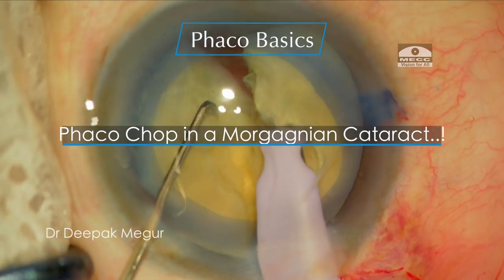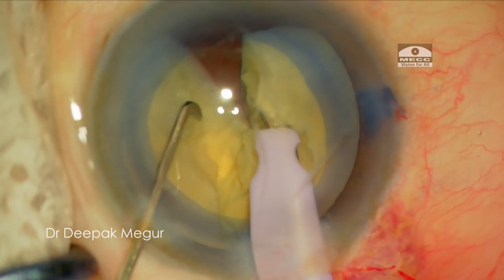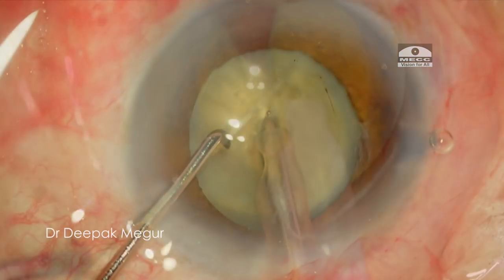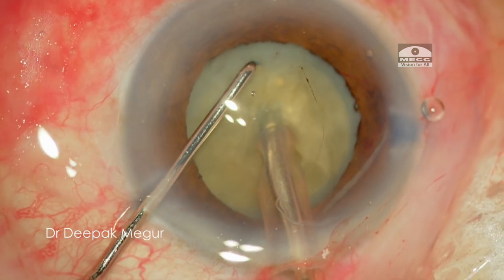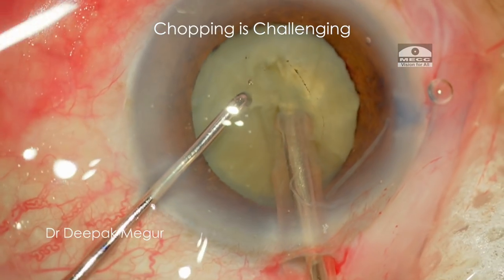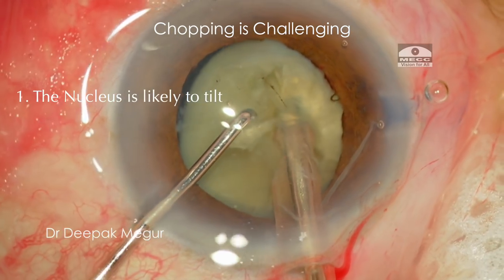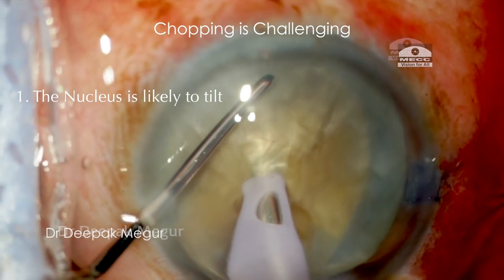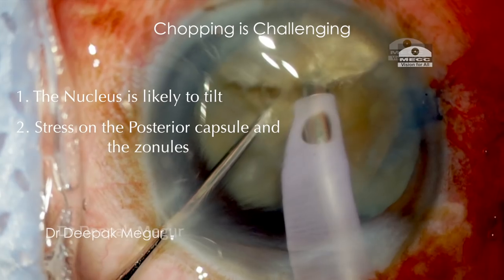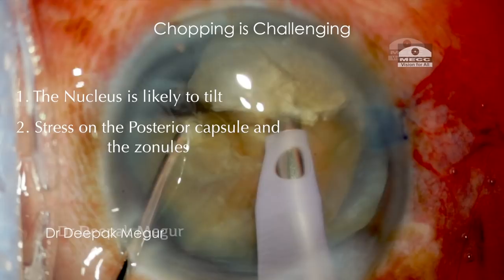There are certain challenges while dealing with such cases. The nucleus is very mobile and freely floating around, and if it is hard then dividing it becomes tricky, especially since these eyes have a thin capsule and fragile zonules. The nucleus is more likely to torque and tilt while we try to chop because of the lack of support, and secondly there is a risk of putting greater stress on the posterior capsule and the zonules during the chopping manoeuvres.